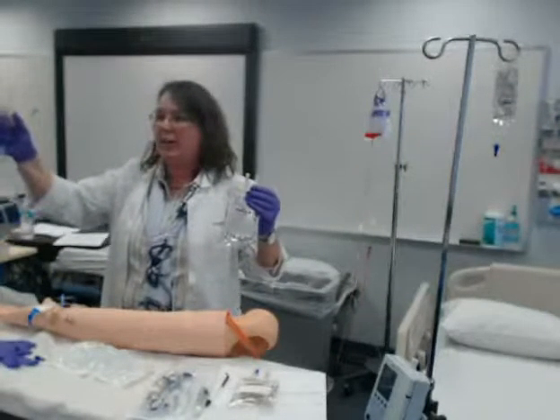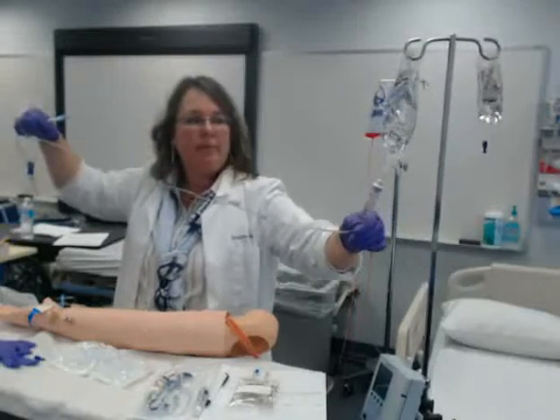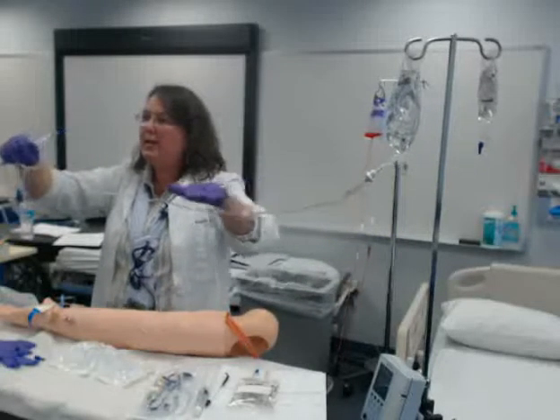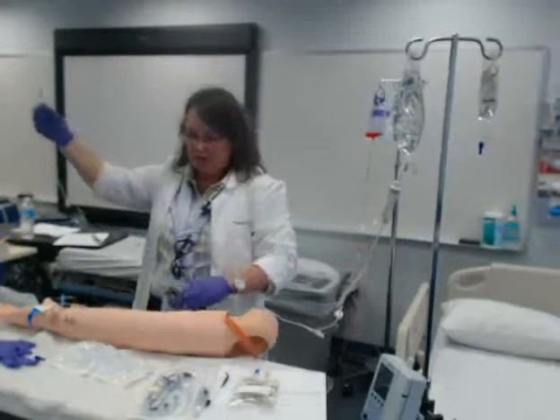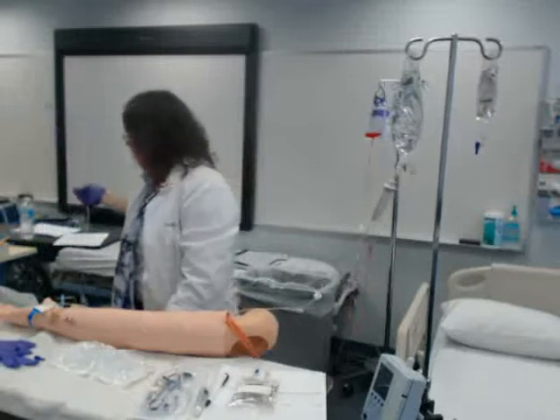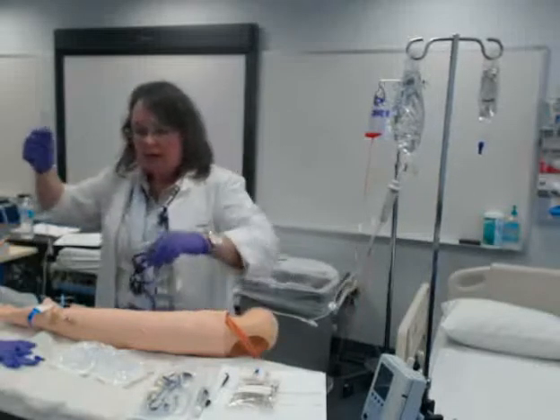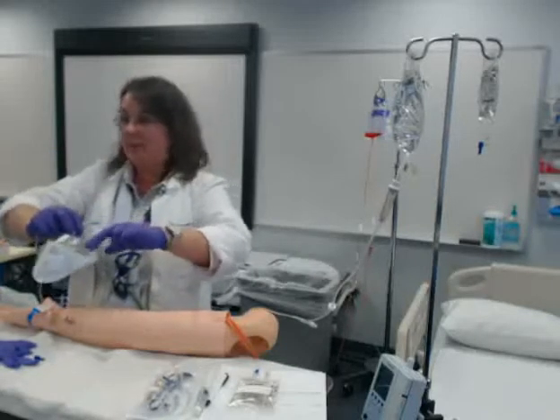I'm not going to touch that cap, ok? It stays sterile. I'm going to put it in my bag. And I'm going to push this in and twist. And just in case I forgot to clamp it, it's going to fill up if I didn't. But I clamped it, so I'm looking to make sure I didn't do that. I'm going to hang that on my pole. I'm keeping all this secure — it's not flopping around.